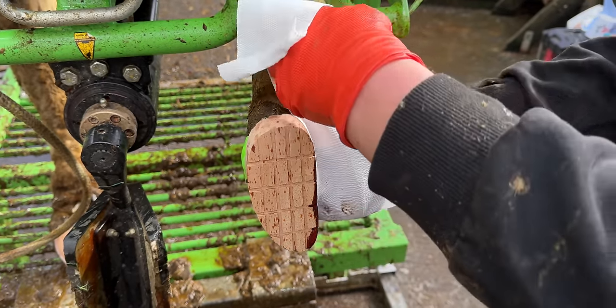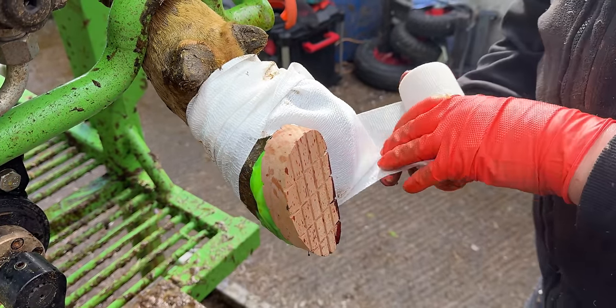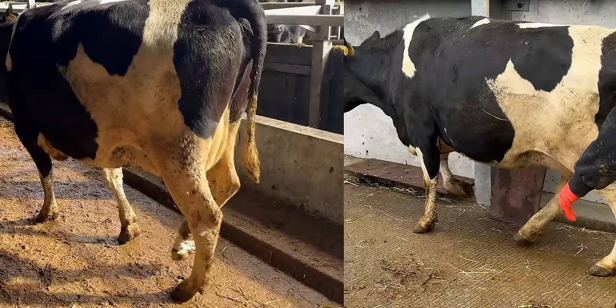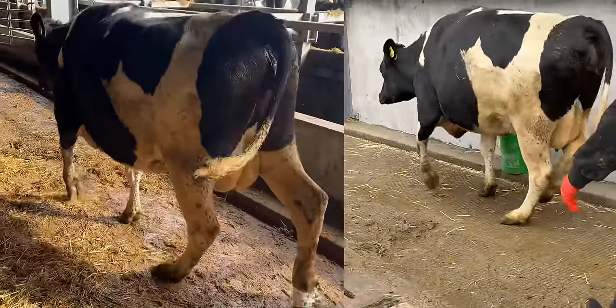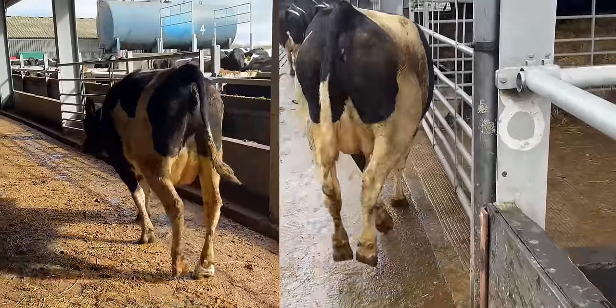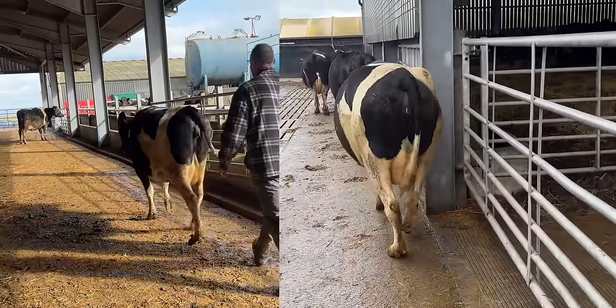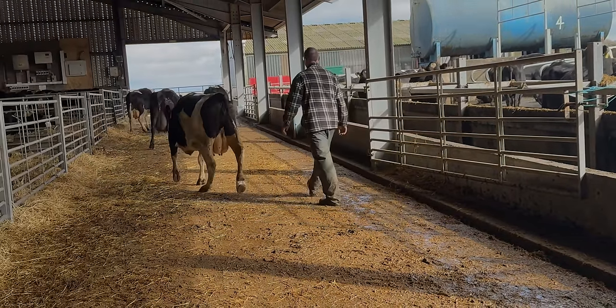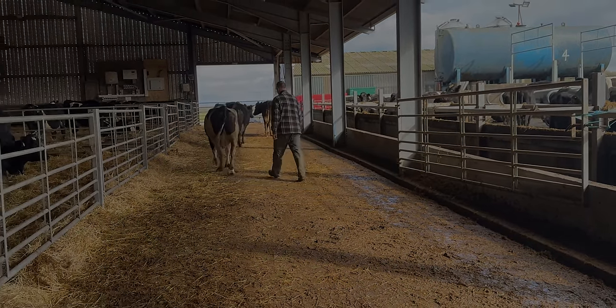All that remains to do for this cow is wrap her foot with some magical paste, let her rip, and see how she's walking compared to earlier on. Actually, that's pretty darn good. She's now putting her full weight on the block. It'll take a day or two until she realises that the pain has really subsided. But as for the complete healing process, that'll take around a month.